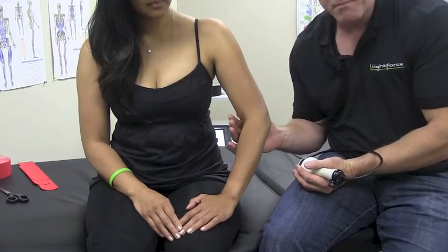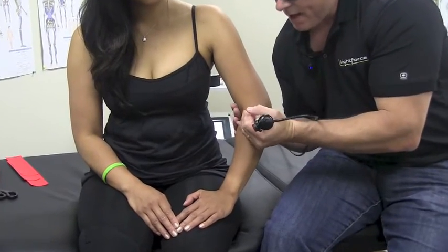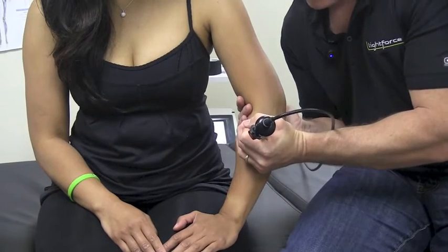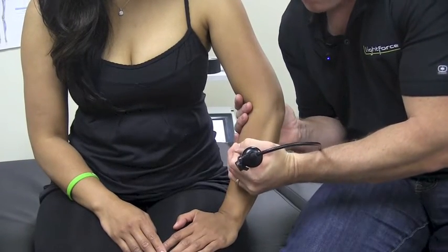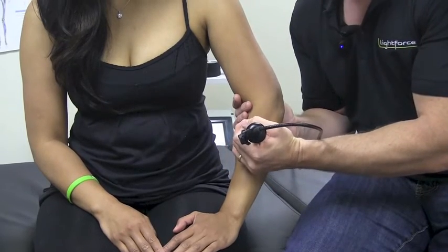I'm going to cradle the arm from behind and then come in from the front so I can have counter pressure pushing this way and then them going down, so I can really get a nice effective release in that area. I'll just gauge patient response to what they're feeling.